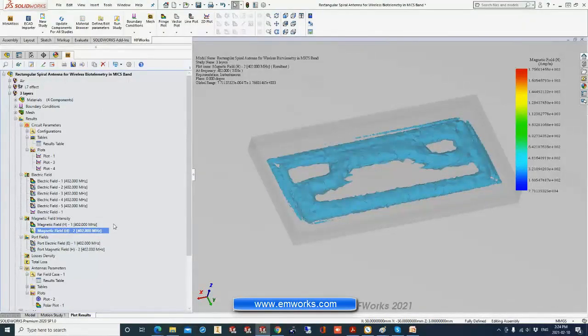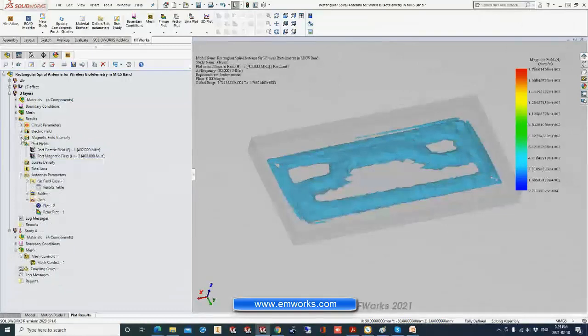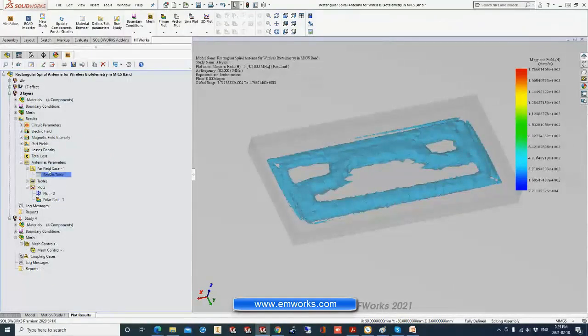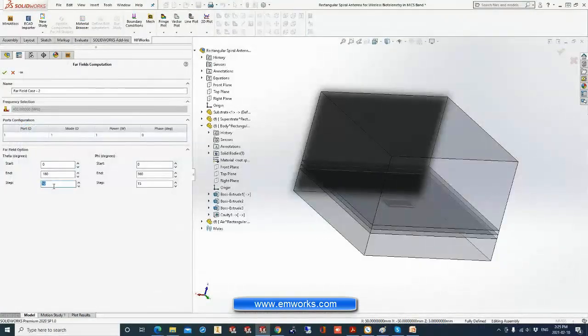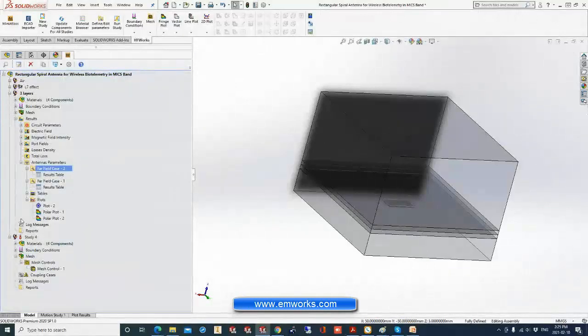Now, as post-processing related to the far field, the far field is also a post-processing process. It means after solving the electric problem, we come here to antenna parameters, and we can create a new far field case, and we can control the step of phi and theta. We can also control the power, and we can solve the problem at this setting. Once you do that, you will be able to create a 3D plot, polar plot, or 2D plot of the far field parameters.